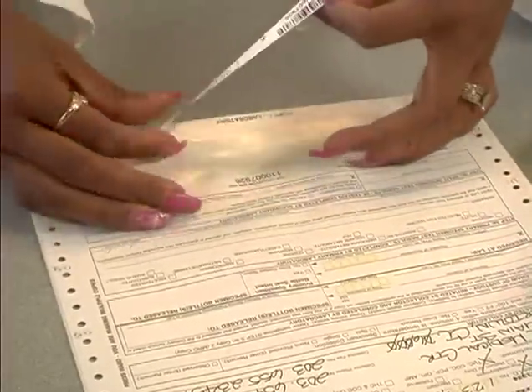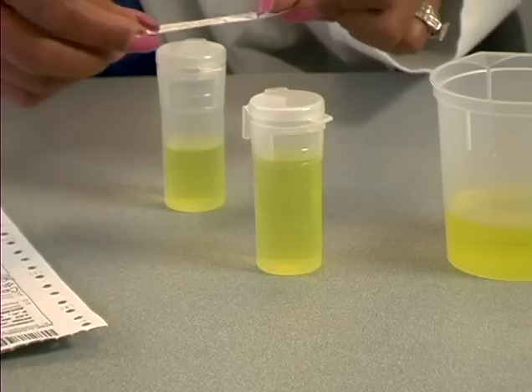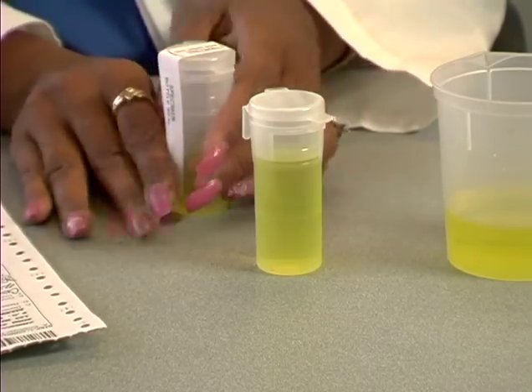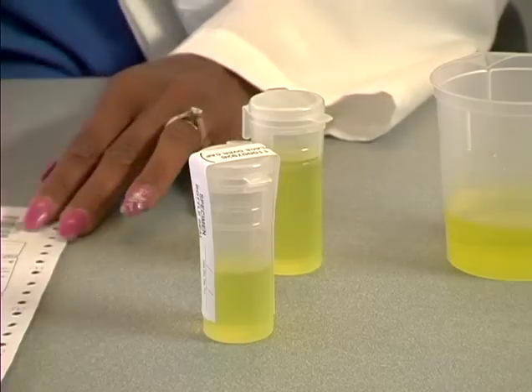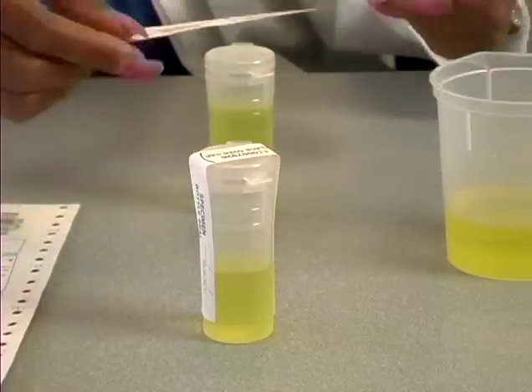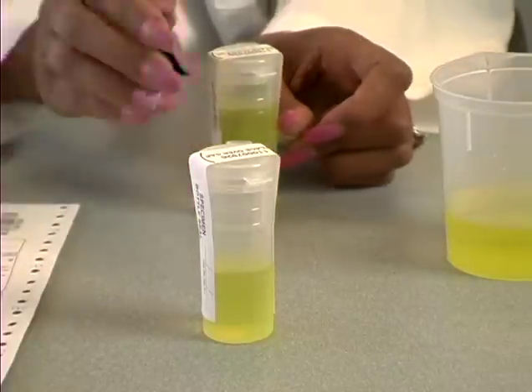Remove the bottle seal labels from the bottom of the CCF and place them over the lids and down the sides of the specimen bottles. The label marked A is used to seal the primary specimen bottle, and the label marked B is used to seal the split specimen bottle. You then write the date on the tamper-evident bottle seals. Though it may be easier to write on a flat surface, DOT collection procedures require that you date the seals only after they are affixed to the bottle.